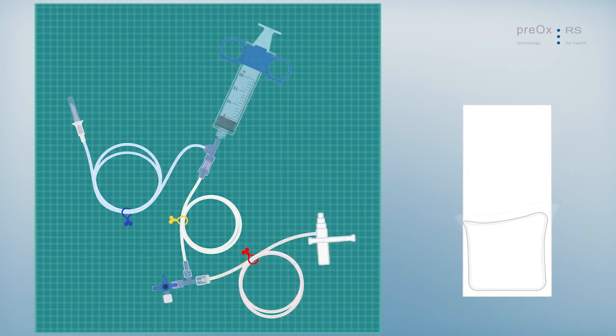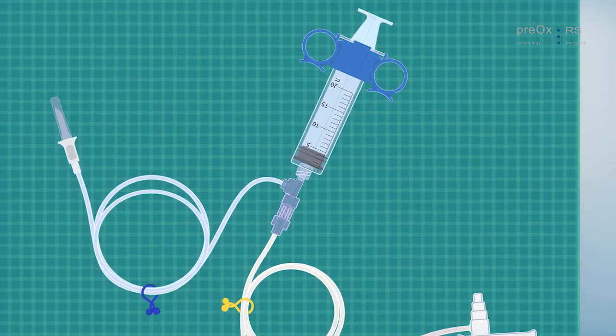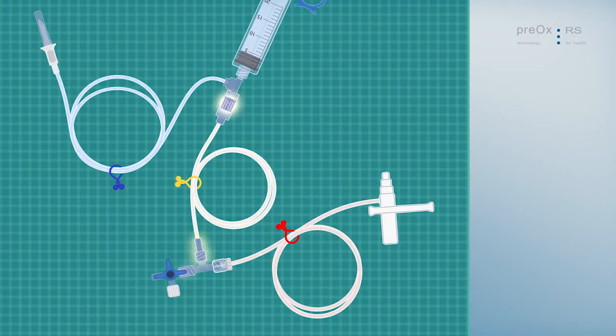Now connect the syringe to the double-check valve. Check the sealing of all luer lock connections.